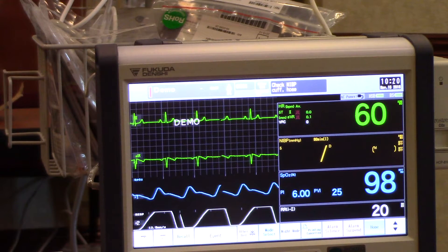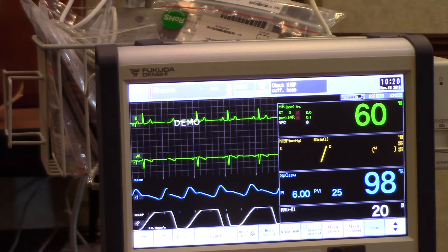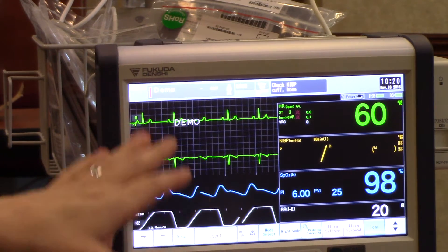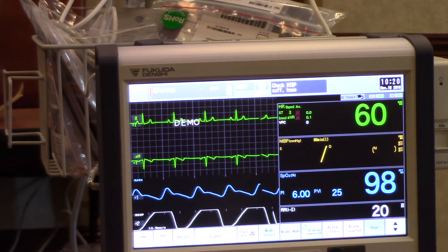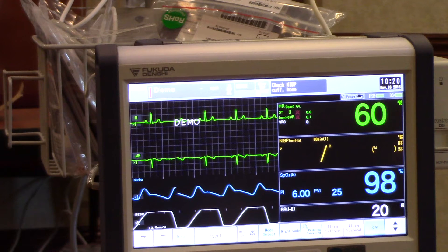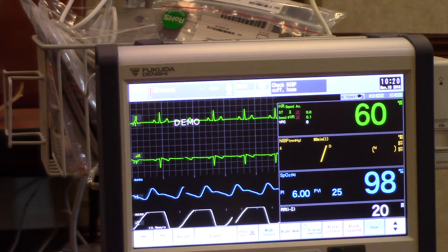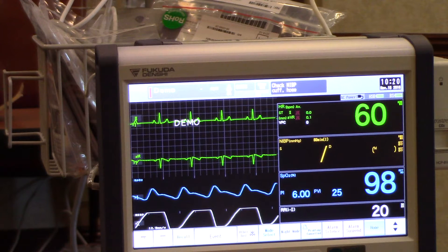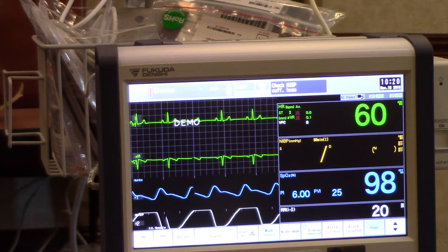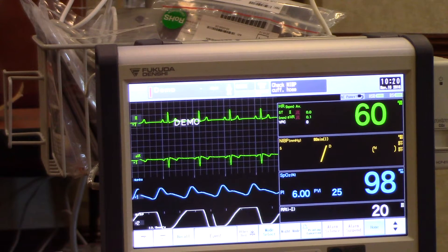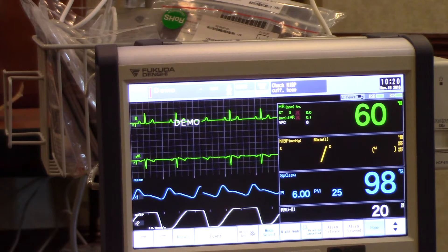So far we've covered the user keys and their function. Now I just want to cover a few things about the user interface on the touch screen. Some of these features may require a charge nurse or super user to access them when we actually go live, but for teaching purposes I'm going to show you how to change alarm parameters based on patient condition and access a few buttons that aren't as obvious as the user keys down at the bottom.